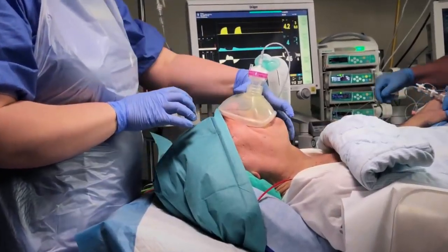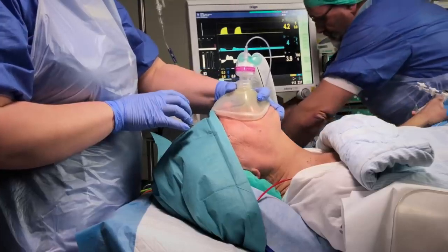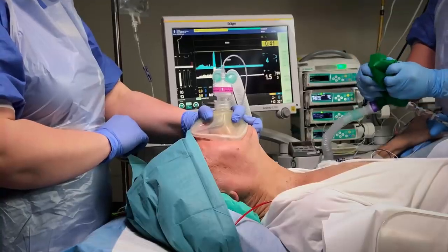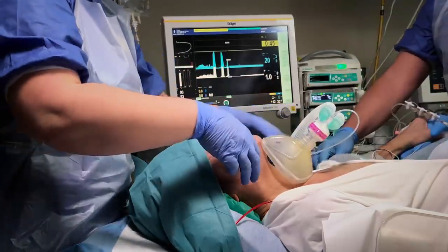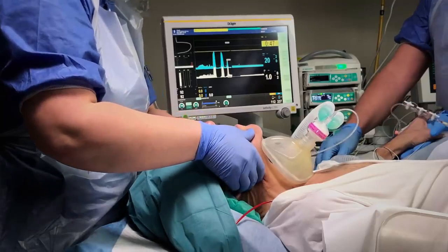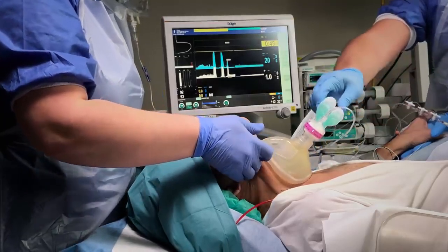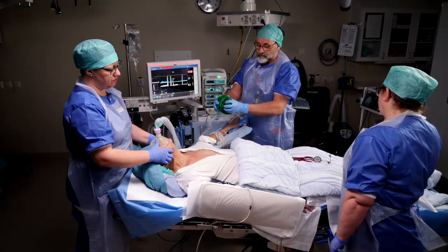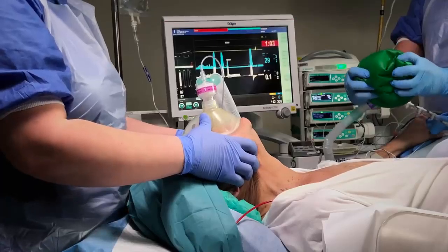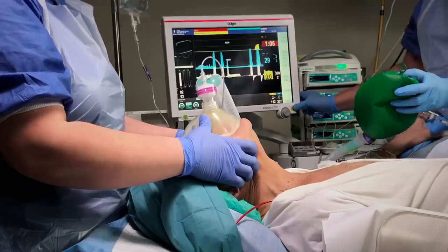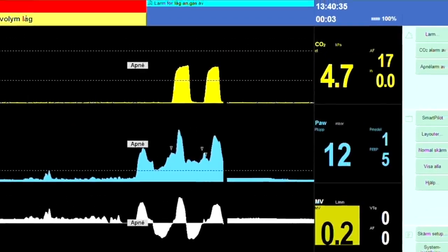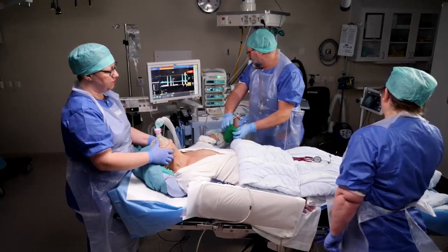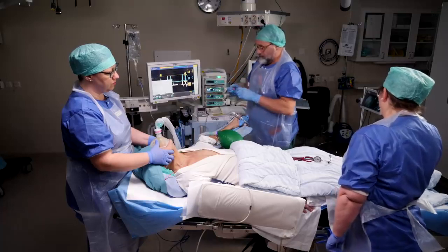Open the airways. A two-finger chin lift may be all it takes. If this isn't enough to ventilate the patient, the next step is a jaw thrust. Open the patient's mouth with your thumbs on the chin and place your fingers firmly behind the angle of the mandible and lift straight up in a decisive manner. Successful ventilation is confirmed by observing the chest wall rising and regular end-tidal CO2 waves on the monitor. If you cannot ventilate the patient at this point, you need to use other equipment and techniques that we will demonstrate in forthcoming videos.